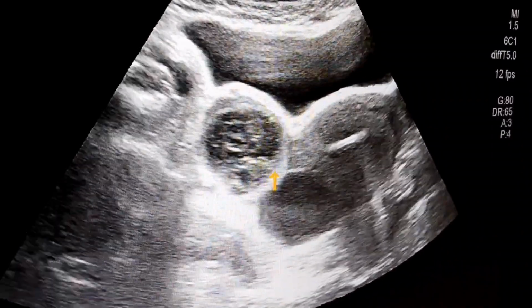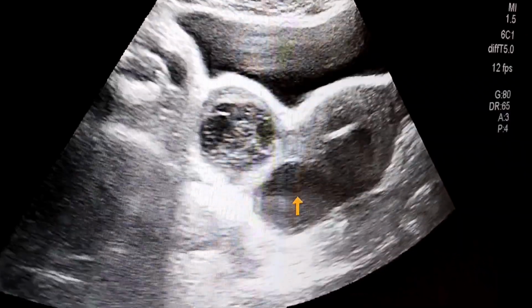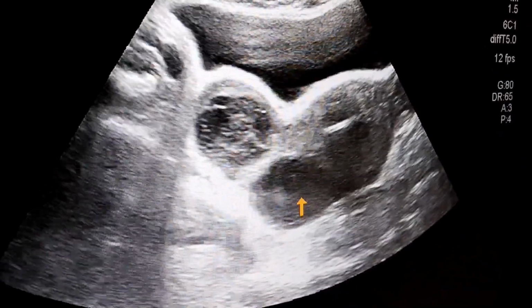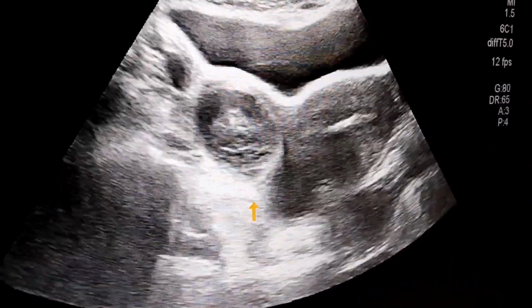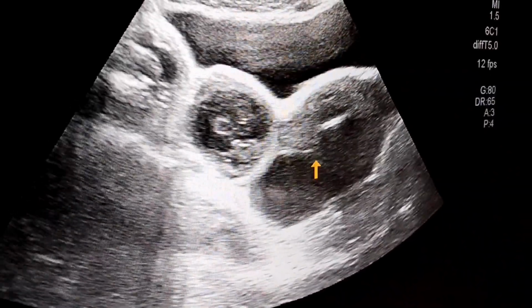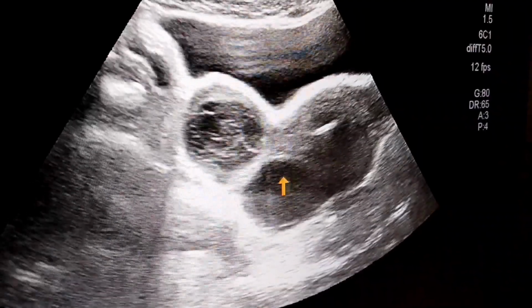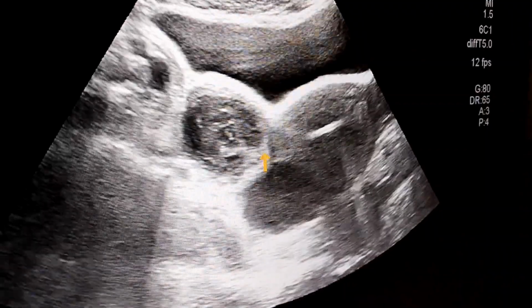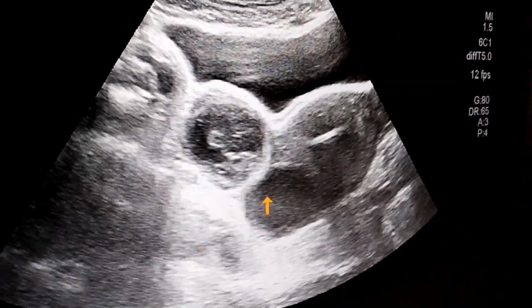So in conclusion, we can say that these two are most likely the hemorrhagic ovarian cyst that is occupying the right-sided ovary close to the uterus, and this cyst seems to be adherent with the uterus, fundus of the uterus. So likely it is a right-sided ovarian hemorrhagic cyst.